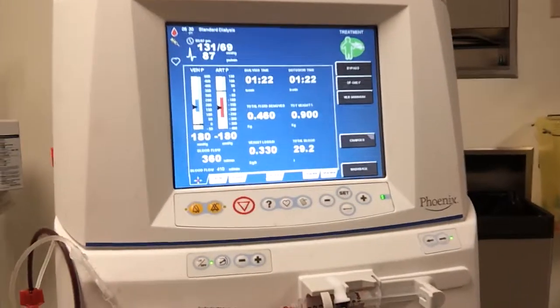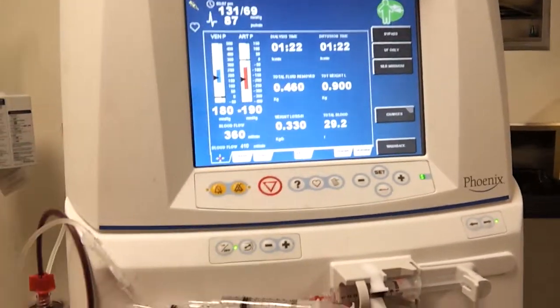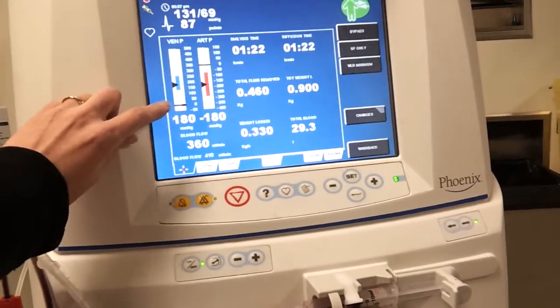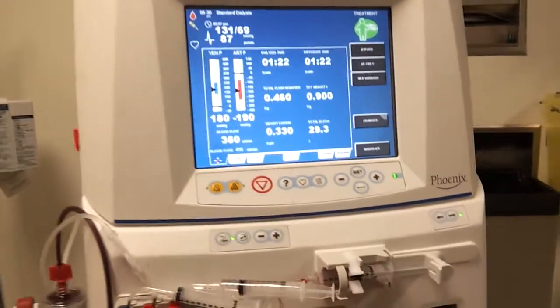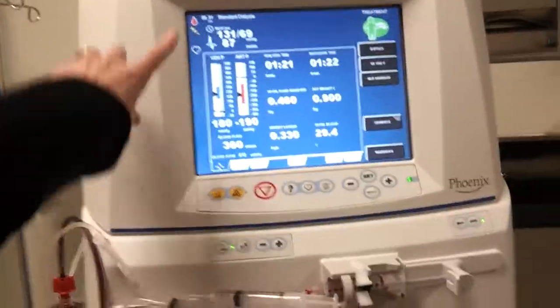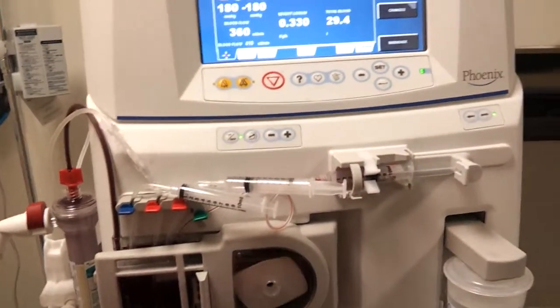So the machine will tell you I have an hour and 22 minutes left. It'll tell you right now there's 360 mils of blood being pumped through my body, so the blood flow is about 410. I don't know if you can see that there or not. And this just tells me how the blood's going through the venous and arterial side. So that's the arterial, this is the venous. So it's spazzing a little right now, doesn't like what I just did. And it tells you what my blood pressure is, what my pulse is, all that kind of fun stuff. Okay, so that's the exciting part of dialysis, aside from the fact, of course, it's keeping me alive.